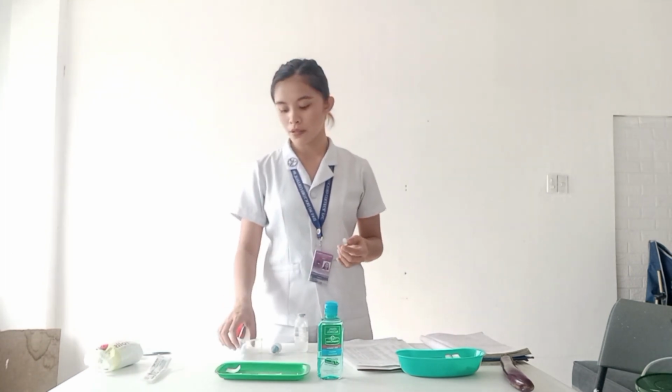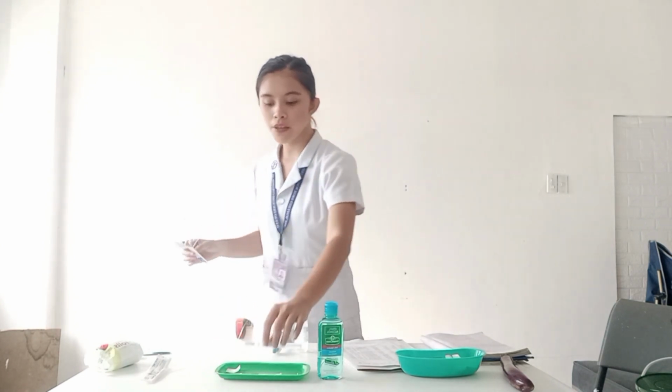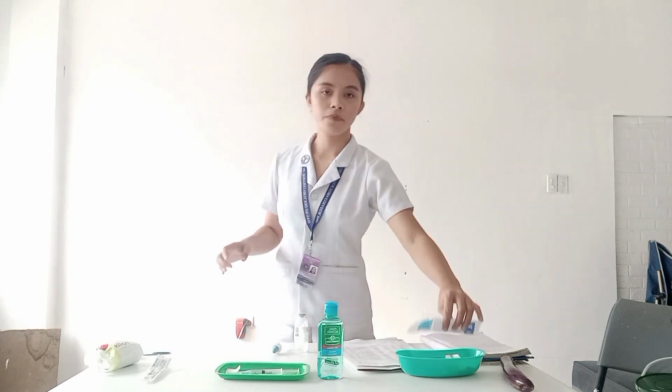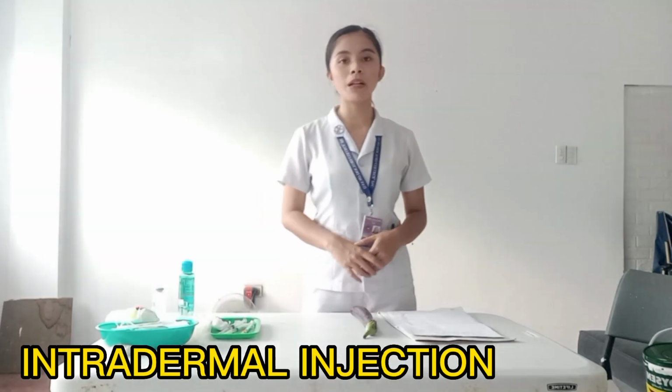So now, in giving an injection, replace the filter needle with a regular needle. Tighten the cap of the needle and push the solution into the needle to the prescribed amount. So now I'll place it on the medication tray. I will now proceed to administering the intradermal injection.